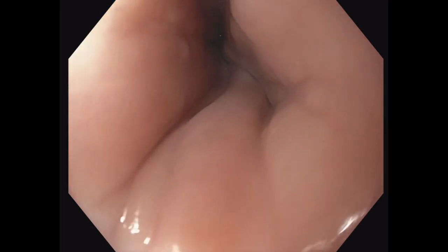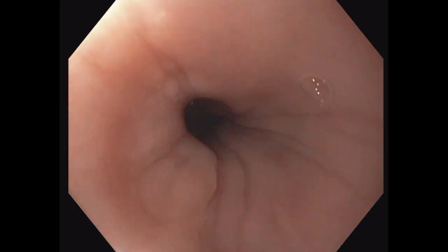Wash out the esophageal wall before advancing this study. You don't want to miss abnormal lesions such as color change, depressive lesion, protruding lesions. Signs of early cancer can be easily missed. Place a scope in the center with a little insufflation to observe the whole area.